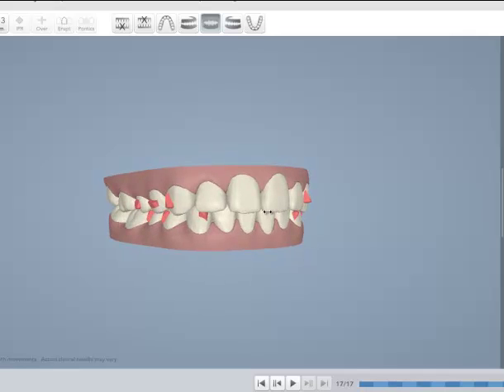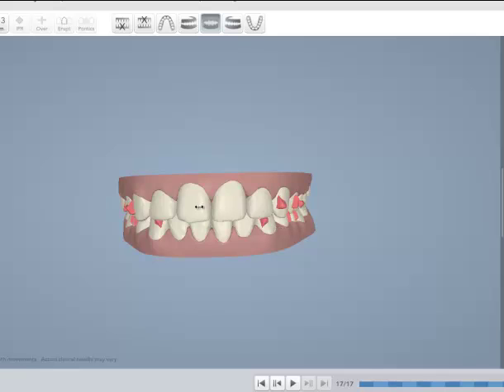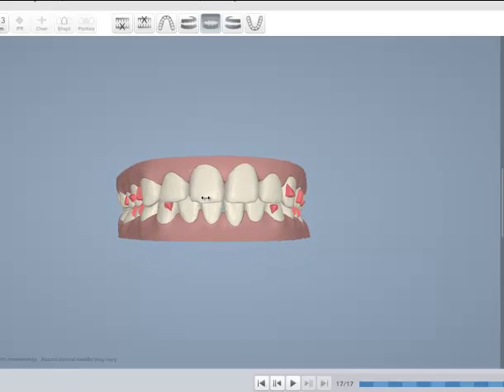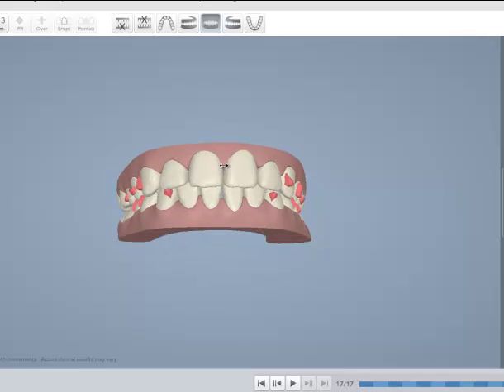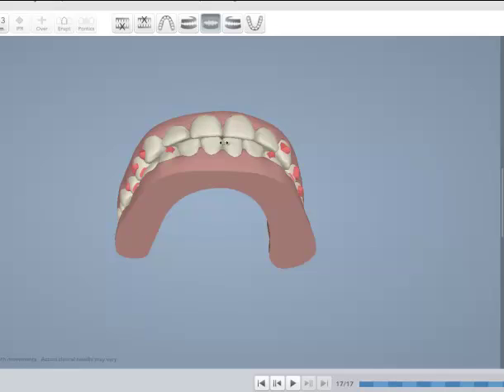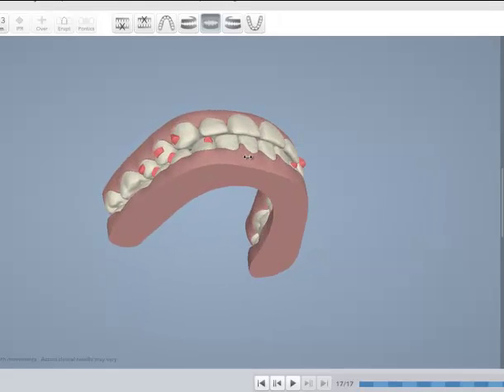The patient is orthognathic. The only thing we should have done better is probably torque the incisors better. But at the time, this ClinCheck is about three years old, we didn't have the use of power ridges on a daily basis.